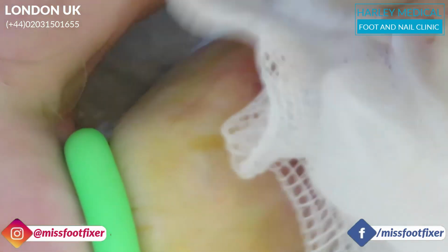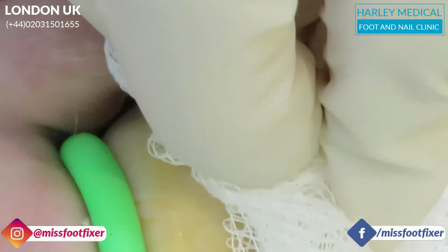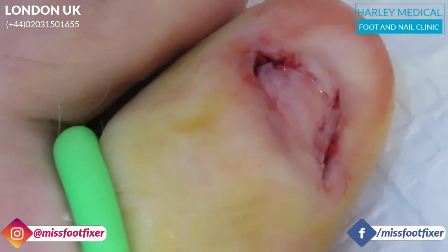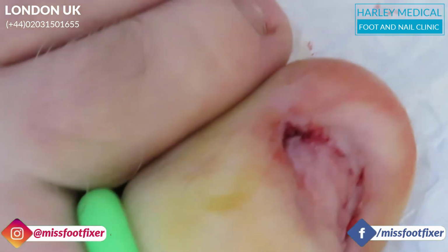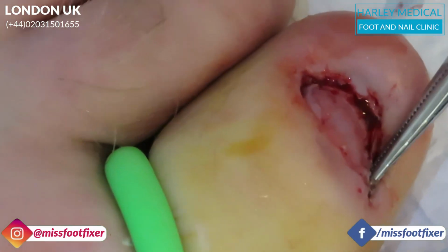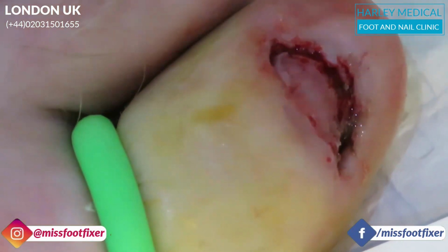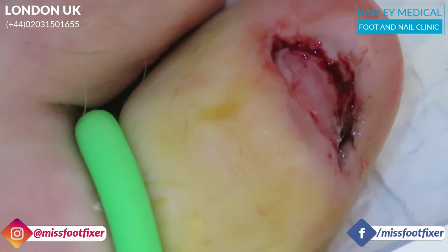So what I need to do is, can you pour some phenol, just a little bit in there, and then I need you to time it for 3 minutes. Oh, that's a lot. A lot of phenol. Pour the whole bottle in, which is fine because we're not putting the whole bottle on the foot, which is great. Just stick it inside. Am I still in? I felt like a foot slip. No, you're good. Can I time for 1 minute for them, please?